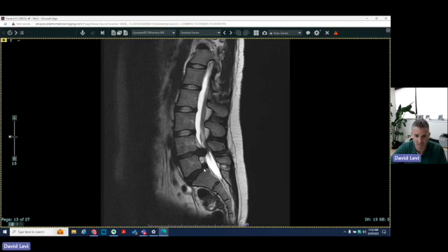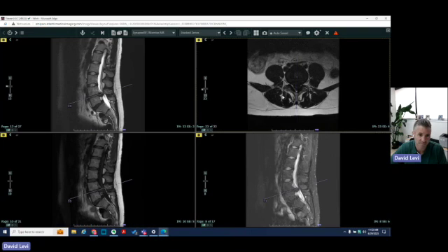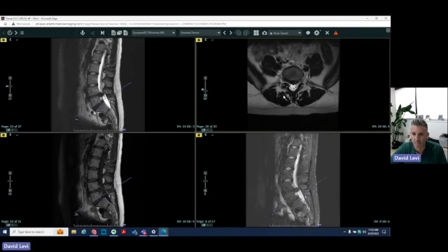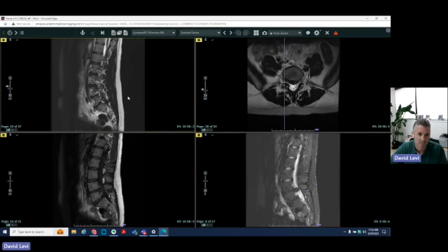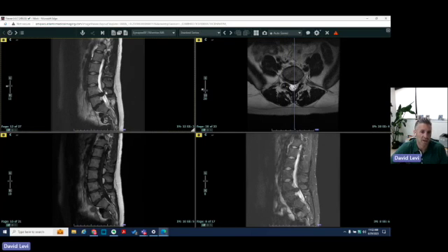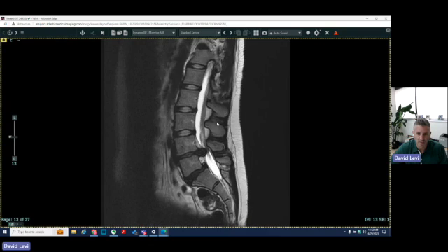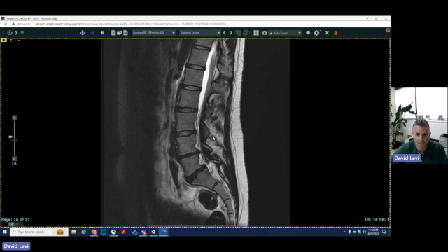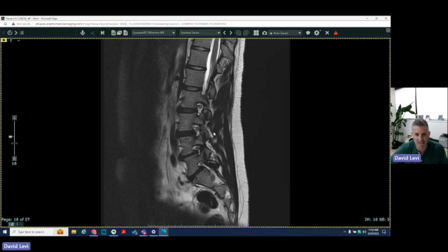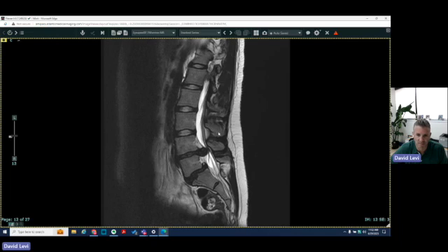At the L5-S1 level, we also see a disc bulge with an additional protrusion — a central or left central protrusion. But her pain is definitely related to the L4-L5 level. We're also able to see the neural foramen very well. Oftentimes disc pathology or protrusion can go out into the neural foramen and impinge any of the exiting nerve roots, but that's not the case with this patient. Her symptoms were related to this large extrusion, which was more centrally located.